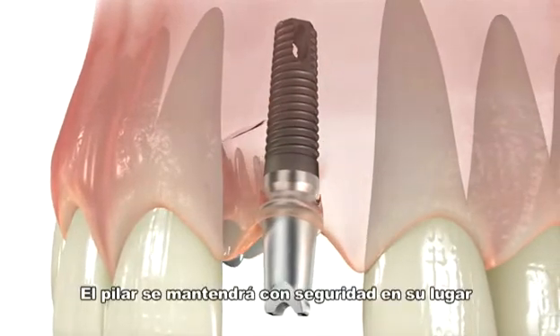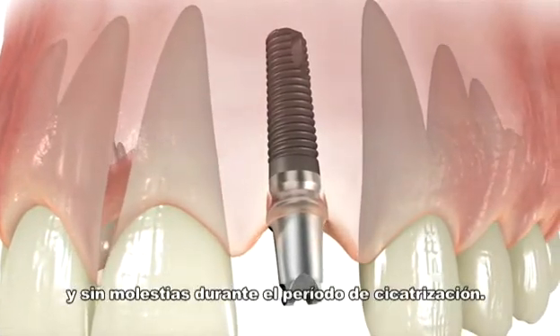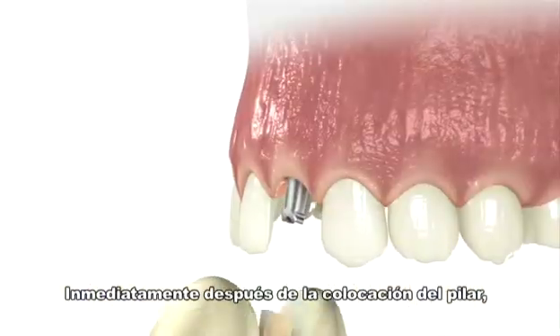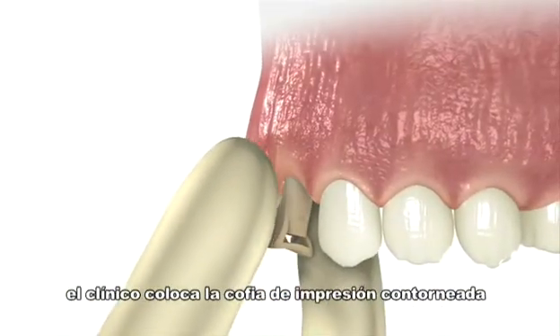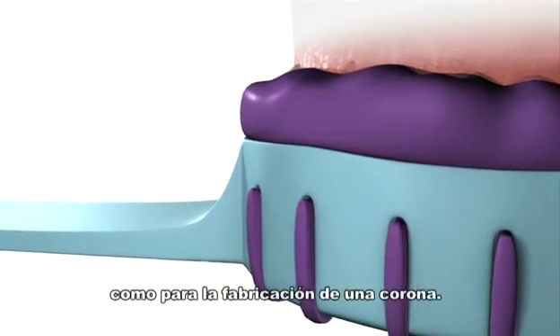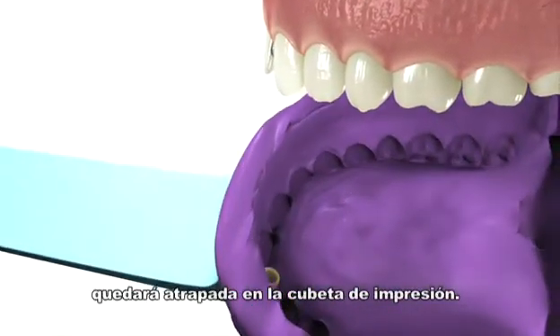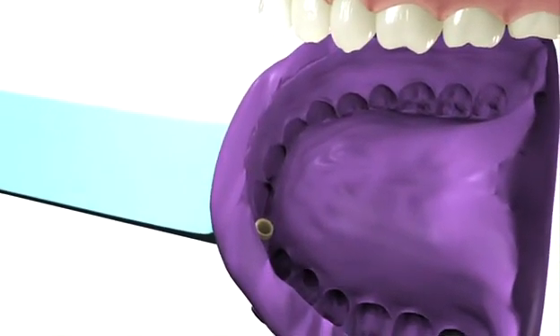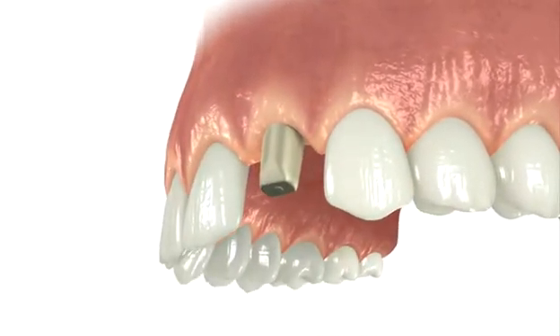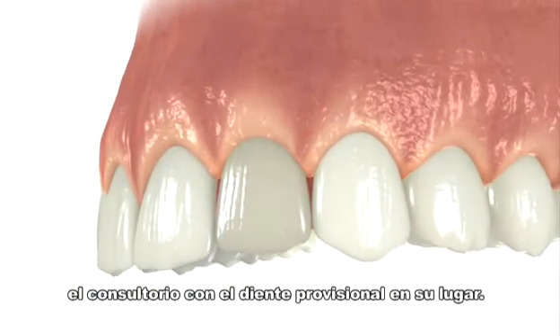The abutment will stay securely in place, allowing tissues to remain intact and undisturbed during the healing period. Immediately following the abutment placement, the clinician snaps on the contour impression cap and makes a conventional crown and bridge impression. The impression cap will be picked up in the impression tray. A provisional crown is made using the contour provisional coping, and the crown is cemented on so the patient leaves the office with a tooth in place.